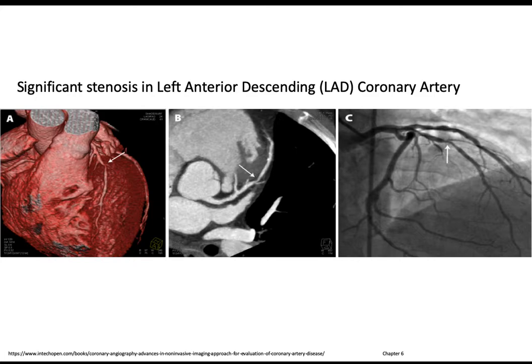You can kind of see it here on this two-dimensional slice, although that's always kind of fraught. You probably want to look at it from multiple views. And then on the right-hand side is the corresponding angiogram, where you went in and put a catheter into this vessel and squirt a little bit of dye that opacifies the image, right? So it turns black because it eats up X-rays. And you can see the branching pattern and see that there's this lesion there.